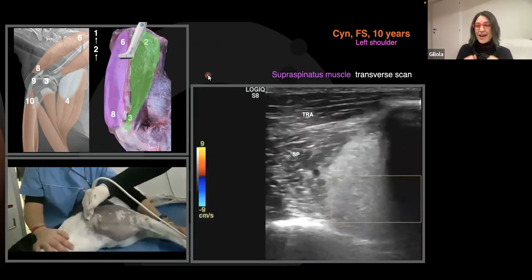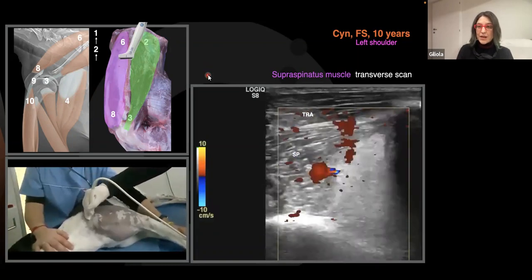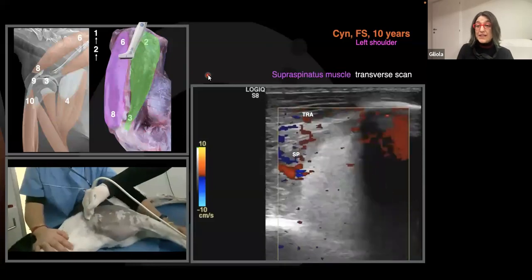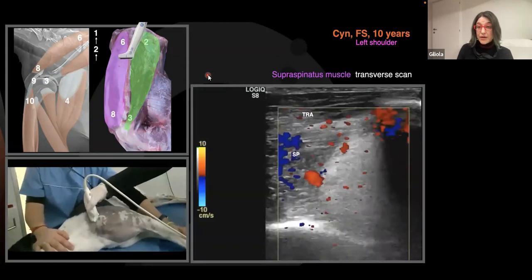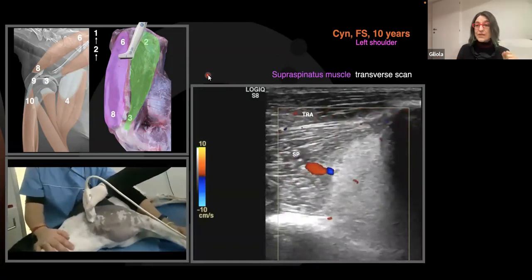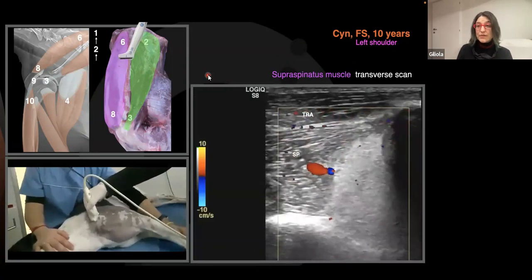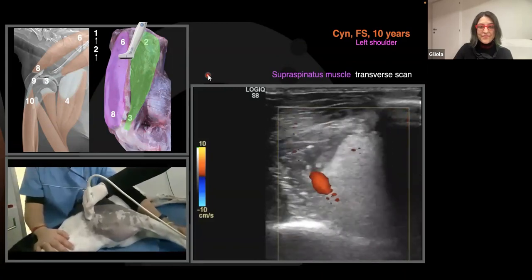And this is how, and when, ultrasound is so sensitive. Scattering artifact is quite a mystery because we don't know why it happened. We only know that it's very, very associated with inflammation. There have been studies in humans where with ultrasound you saw scattering artifact in the peritoneum. They opened the patient, they didn't find peritonitis, but they took out a sample based on ultrasound, and on histology there was peritonitis. So this artifact is more sensitive than the eyes looking directly at the tissue.